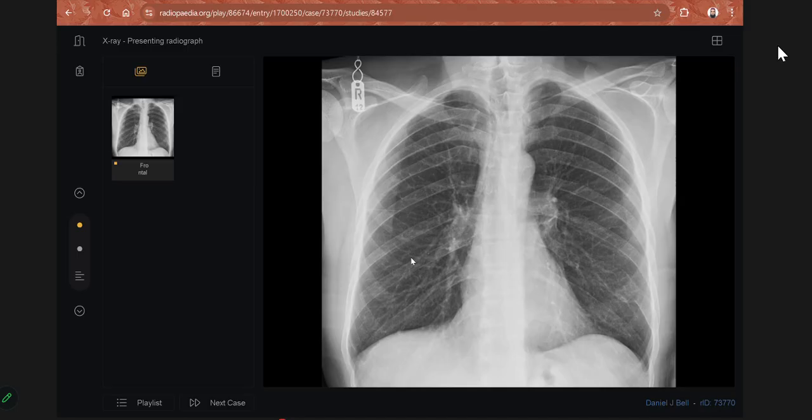Will you please focus on the rib cage? Okay, so I think there is some expansile lesion involving the eighth posterior rib on the left side. If this is a young adult, I would be thinking of the possibility of fibrous dysplasia, otherwise Langerhans cell histiocytosis. The third differential would be a brown tumor. Good. I will discuss the findings and ask for the differential.